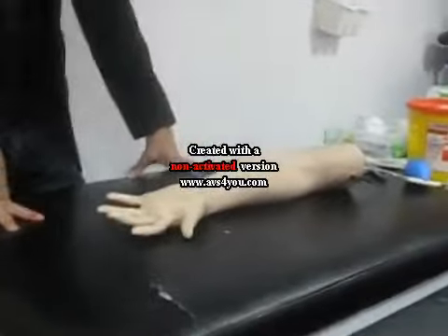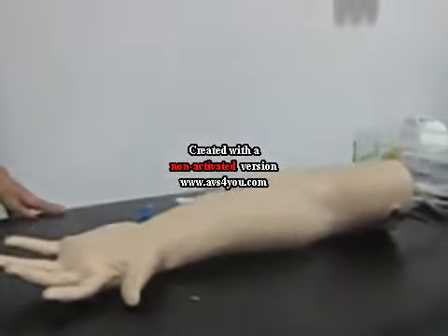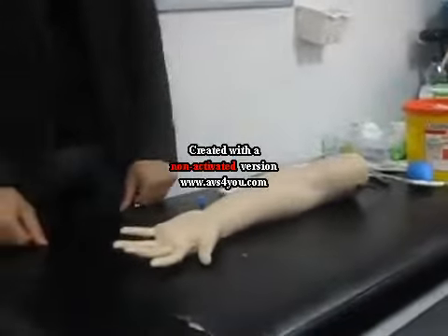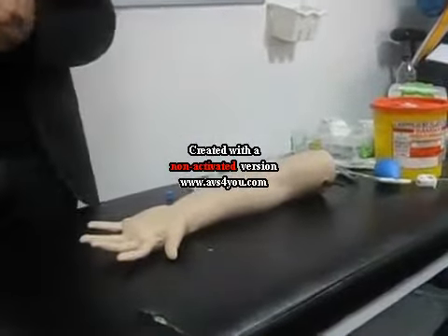Right, this is Mr. Allen, and he's coming to the hospital. He's admitted in the ICU, the intensive care unit, and I'm the senior house officer. My task is to take a sample for ABGs, arterial blood gases. Hello, examiner. This is my reference number. Can I please proceed? Yes.